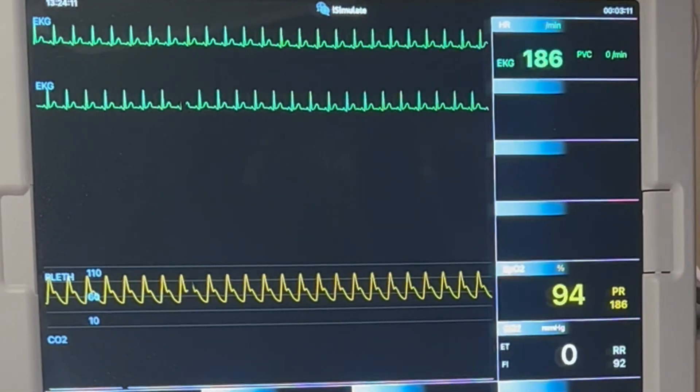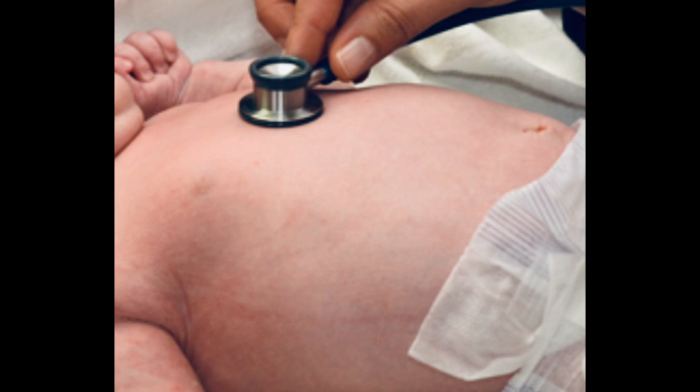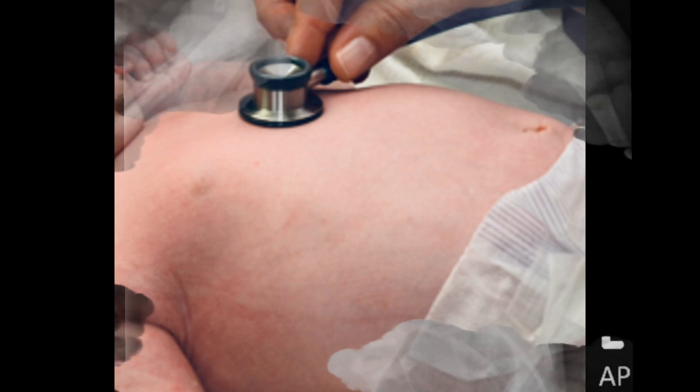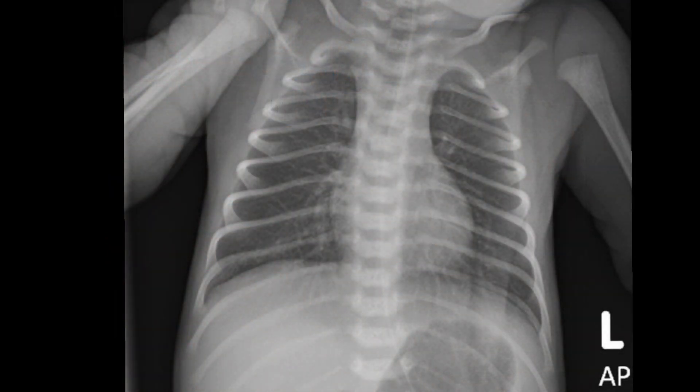Throughout the procedure, you'll want to perform cardiopulmonary monitoring and assess the patient before and after the procedure is completed. You should also consider getting a chest X-ray at this time to ensure the pneumo has resolved, or if you need to move on to a chest tube.